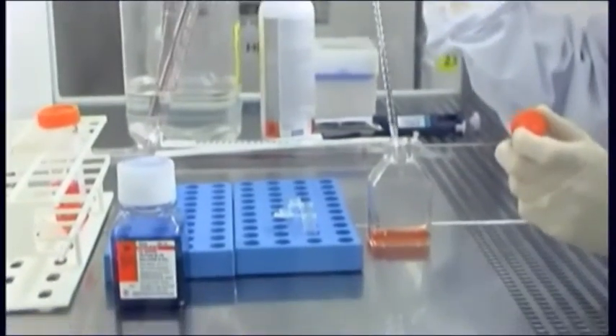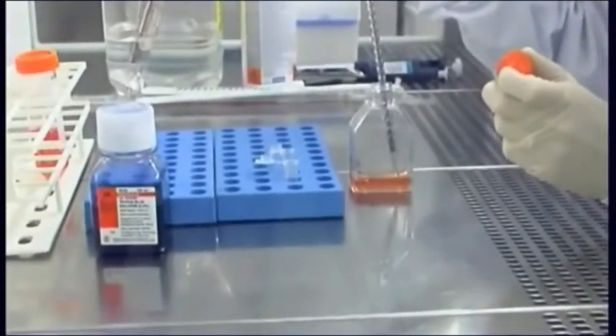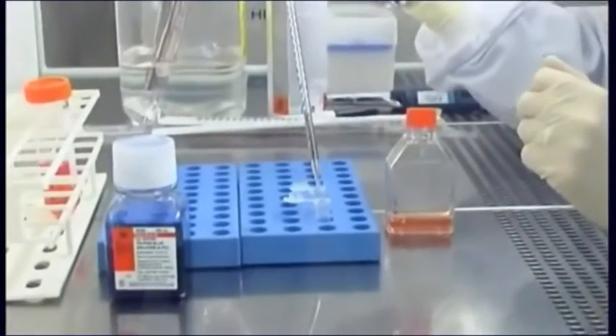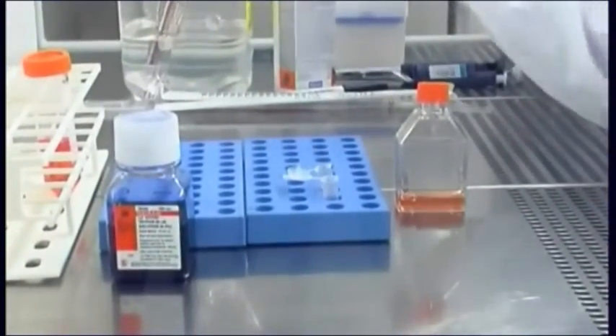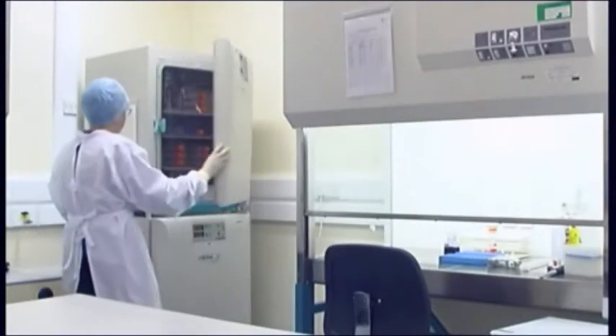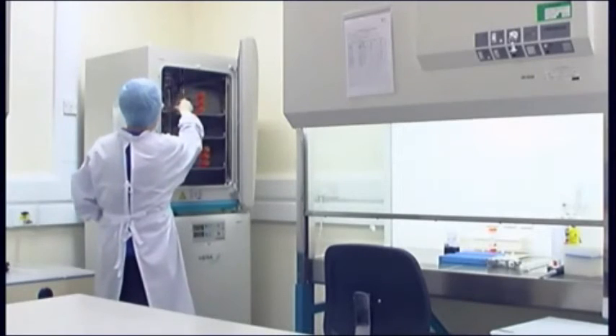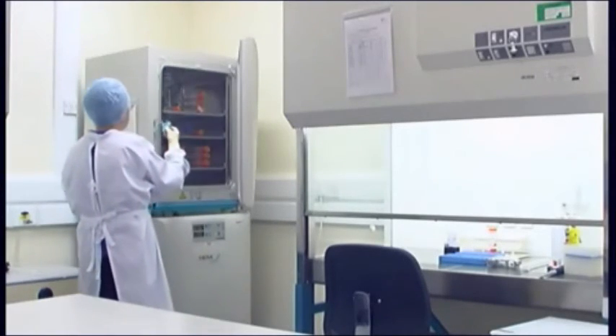Take a sample of culture to count cells. Determine you have sufficient concentration for growth greater than minimum seeding density. Transfer cells to incubator. Examine the cells microscopically after 24 hours. Add subculture as necessary.